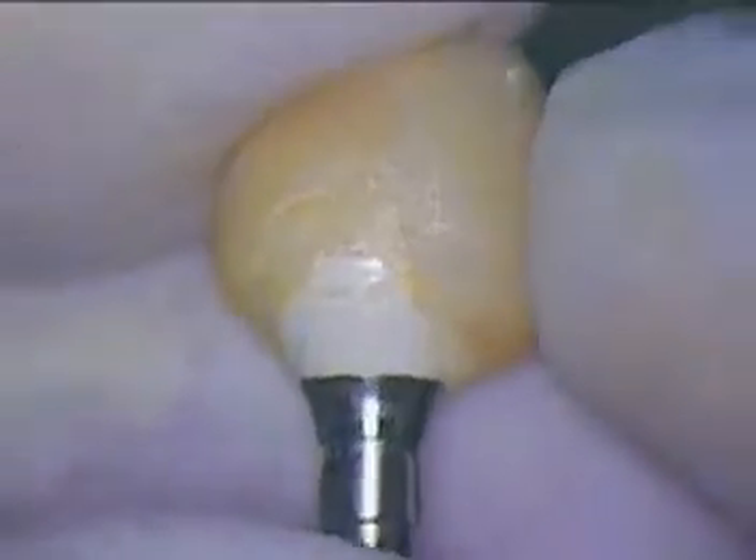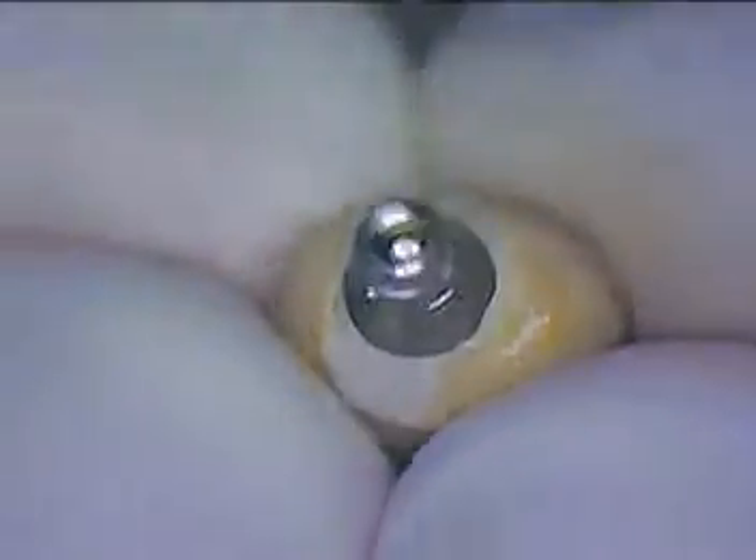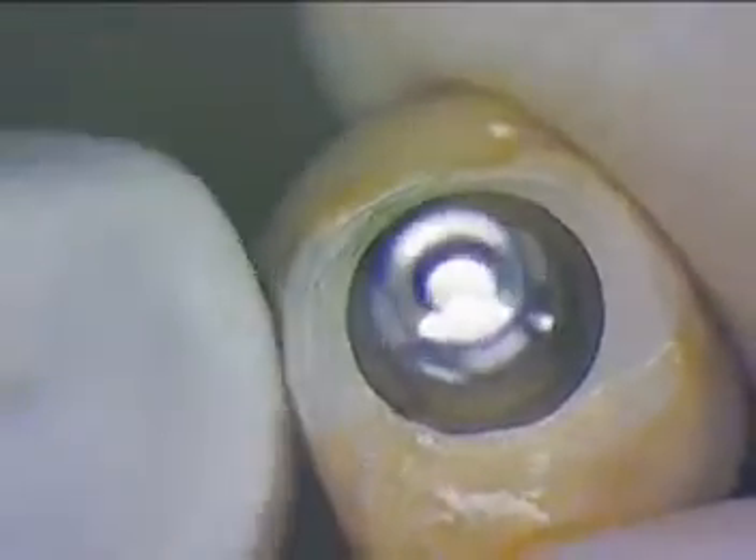This is the immediate temporary that was made using the peak abutment. If you notice the underside is not as highly polished as I'd like to see. My other requirement is also not to ditch the area underneath the soft tissue.